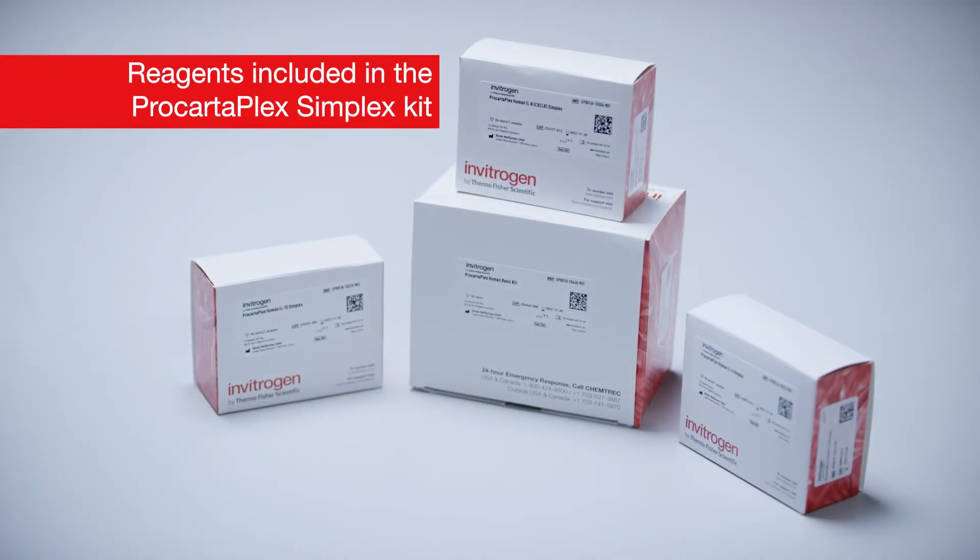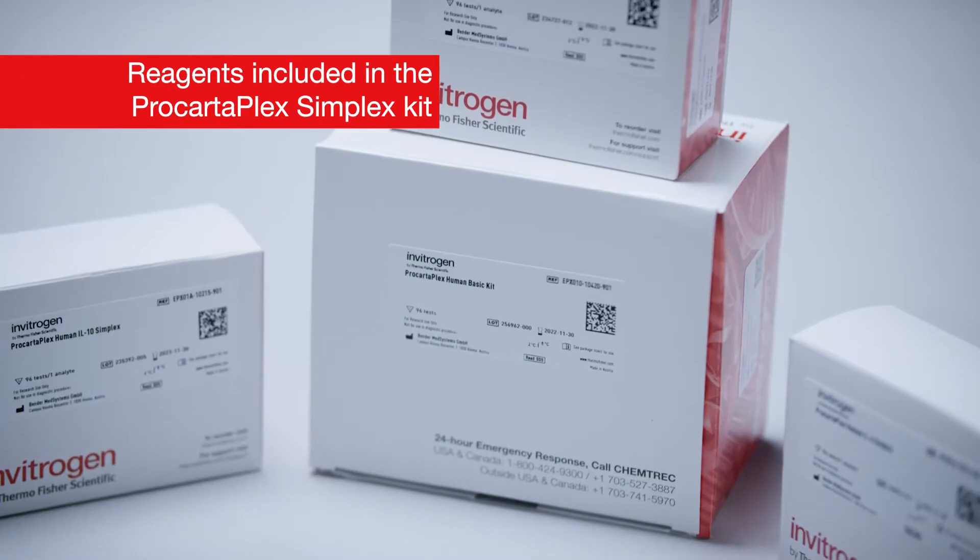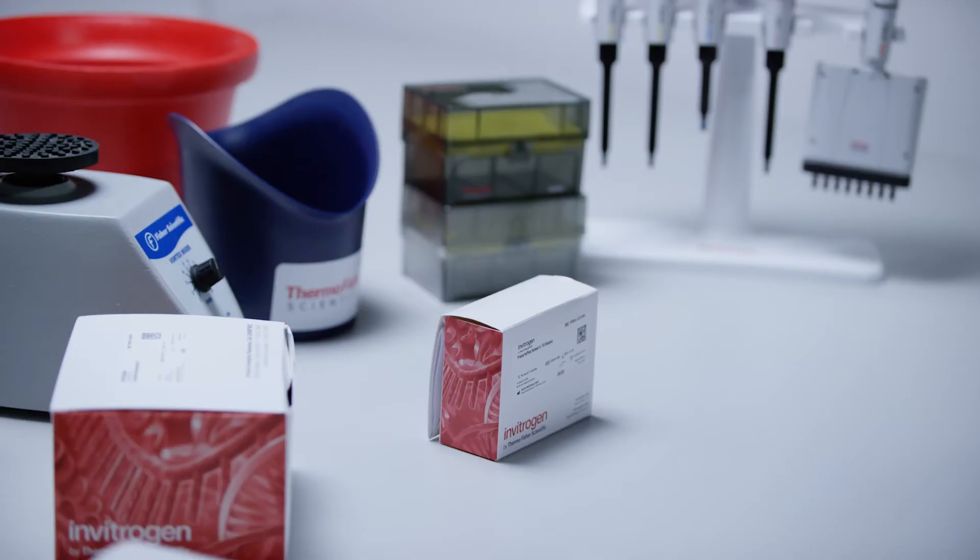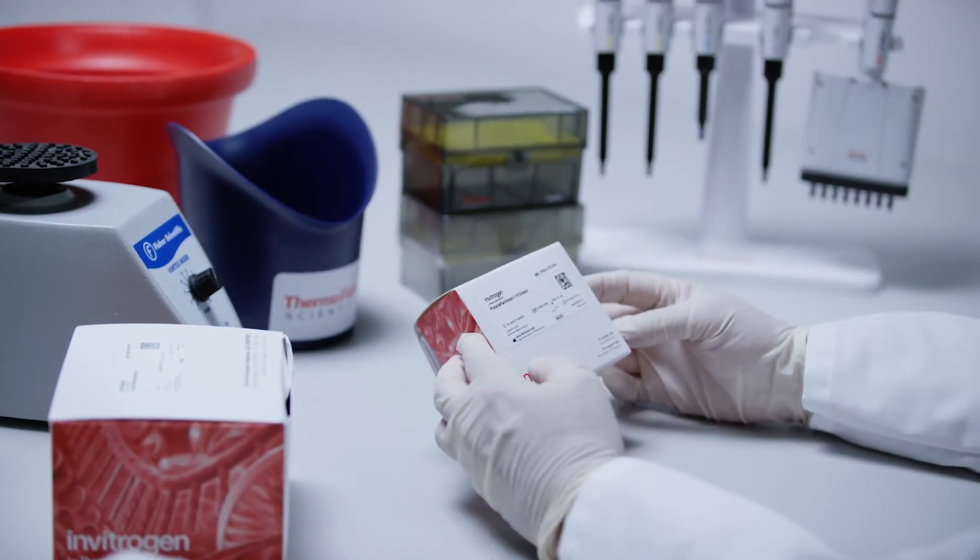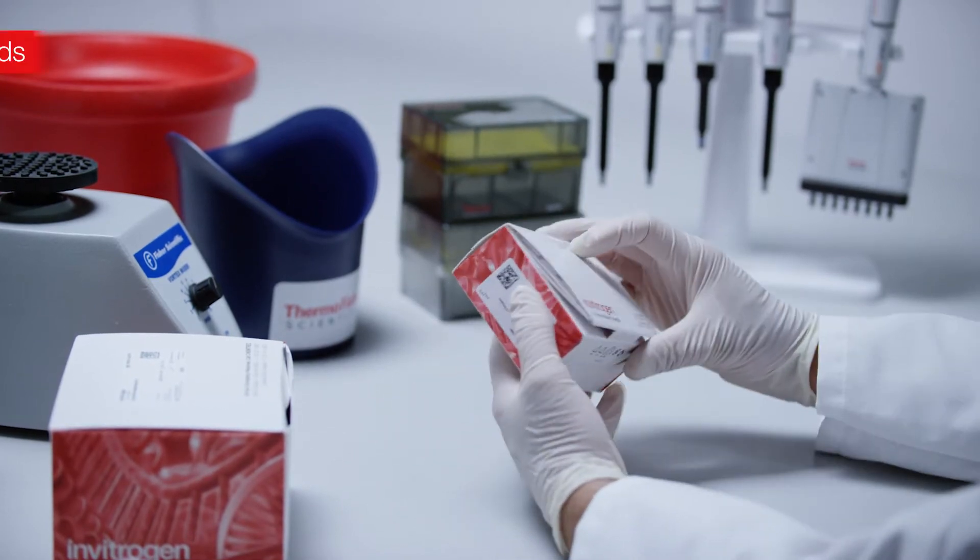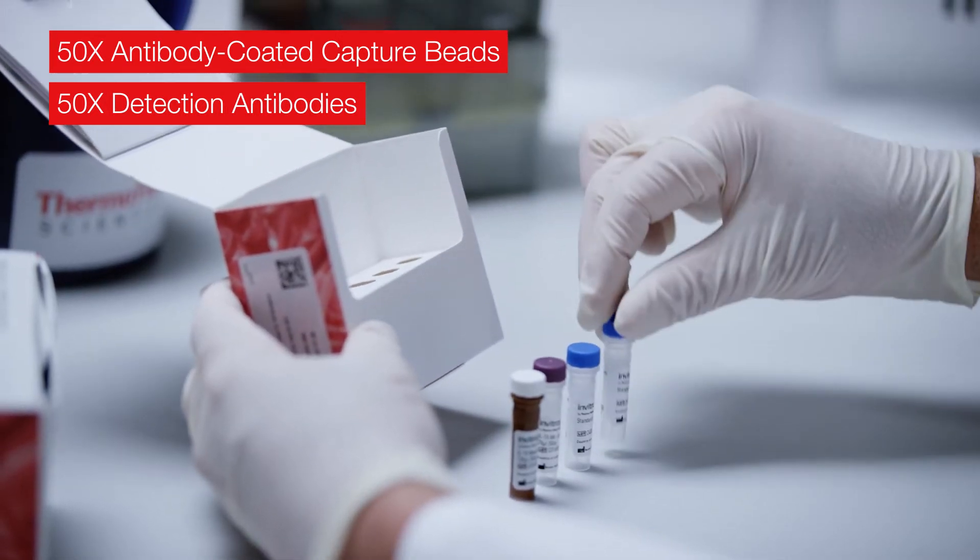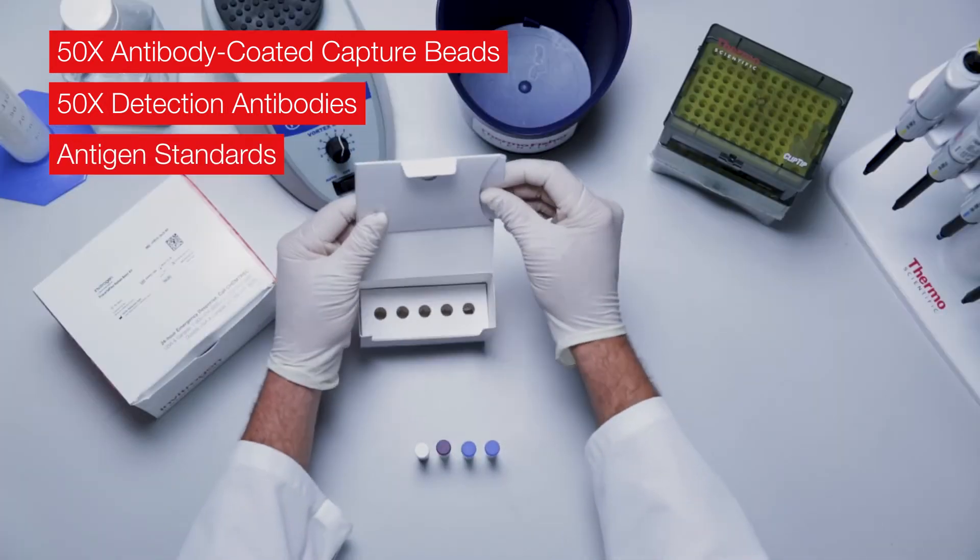For running simplex kits, you will need the individual simplex kit plus a basic kit. Each simplex kit is specific for an individual target and contains 50x antibody-coated capture beads, 50x detection antibodies, and antigen standards.